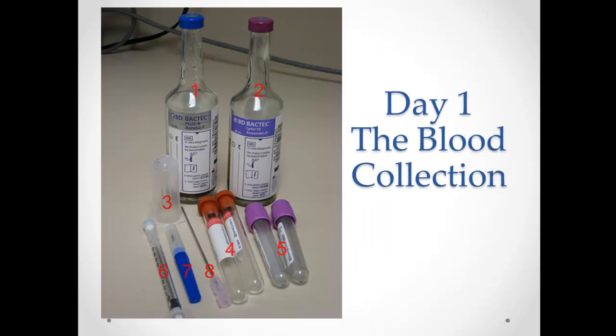Here are the actual blood culture collection bottles — those little vials at the bottom of the picture. There's a vacuum in there and the blood will just squirt right in, so you can draw straight into those. If you're drawing with a butterfly, it's usually a little easier, but you can use the adapter shown as number 3 in that picture. There are two bottles: an aerobic and an anaerobic bottle.